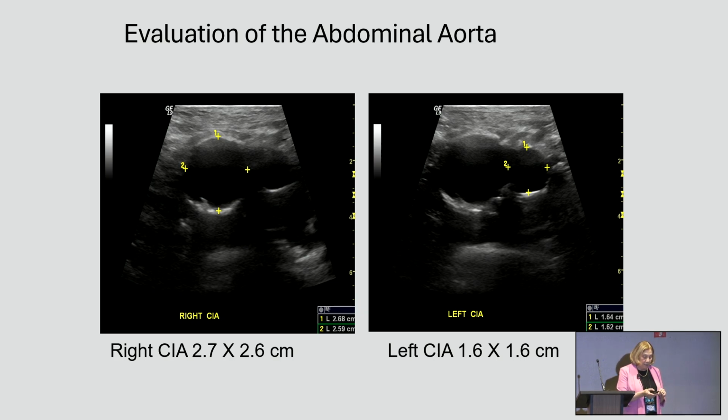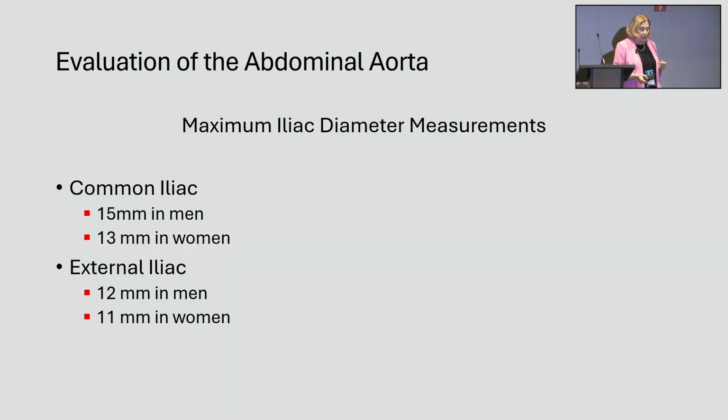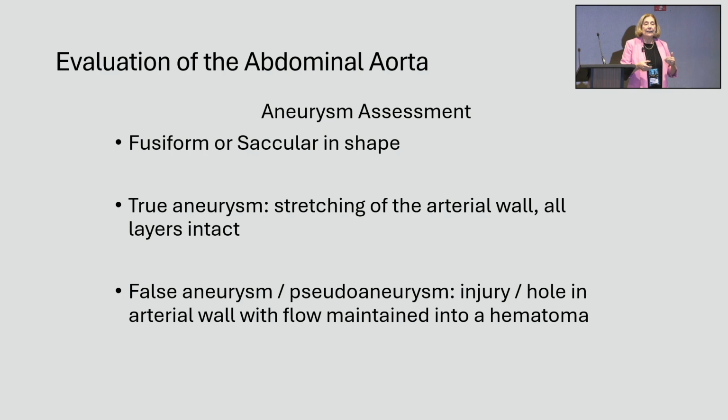So as we come down now into a division of that distal one circle aorta into a division into two circles, you have a very large right common iliac artery and a left iliac artery that is sort of in this range. But again, is it a man, is it a woman? And the main thing we're going to see here is that both of them, one is slightly generous, the other one is significantly generous, but hasn't reached 3 yet. Again, all things looking at, is the aorta really small at the distal end? Compare everything to that patient.